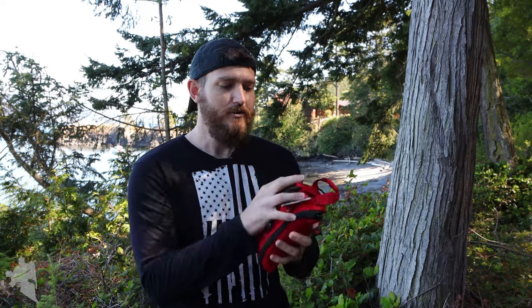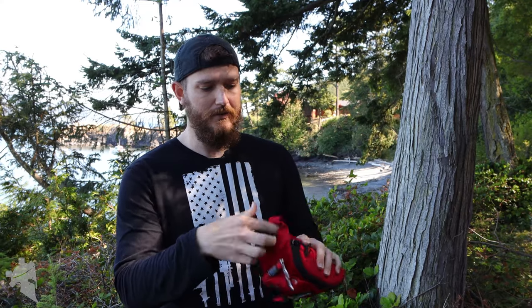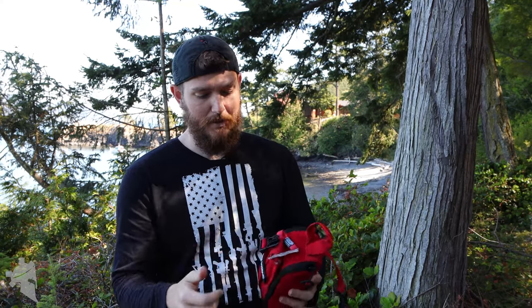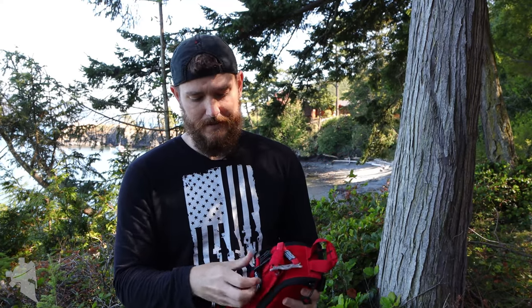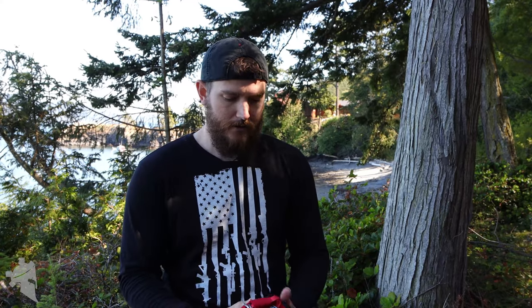The actual kit itself has a MOLLE back that is velcroed onto the back of the panel. You have to undo the strap and then you can physically pull the panel away from the actual pouch and rip it off of your bag, your range bag, your kit if you're wearing it on your kit — whatever — and go directly to the casualty with your medical kit. You can also rip it off and toss it to someone who is actually qualified as a medic. Velcro — awesome, cool feature.